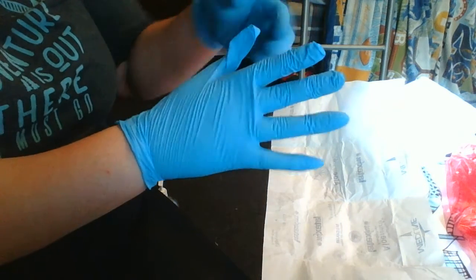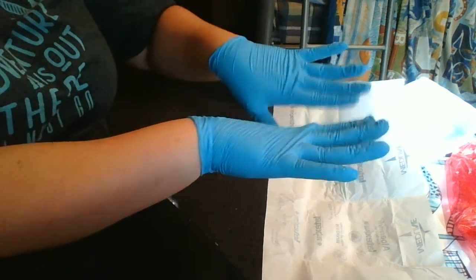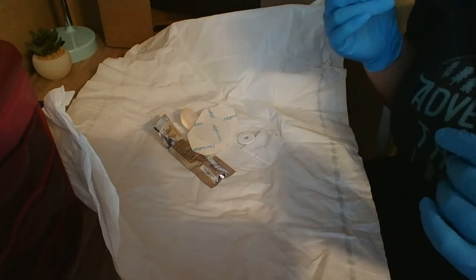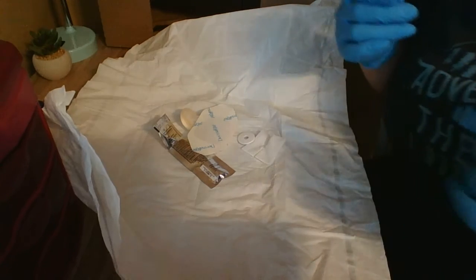Our sterile gloves. There we go. Turn it around. And then we kind of just want to get everything set up so it's easily accessible when we're doing the actual procedure.